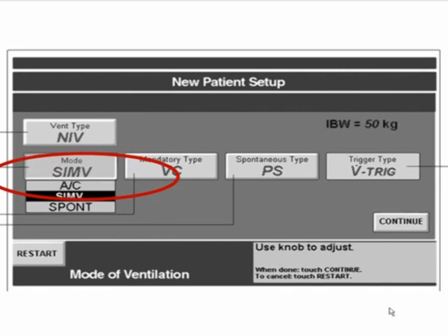So for instance, let's say you set the patient at 10 breaths per minute and 500 cc's per breath. All right, if the patient's unconscious, you gave them a ton of sedation, they're going to get those 10 breaths and 500 cc's per breath. Now the patient's waking up and they're over-breathing the vent. They're taking a couple extra breaths. Each of those extra breaths, they'll initiate, but the ventilator will give all of the support. It'll give 500 cc's. The patient won't really be doing any work. That's assist control. It'll work just fine for any of your ED patients.